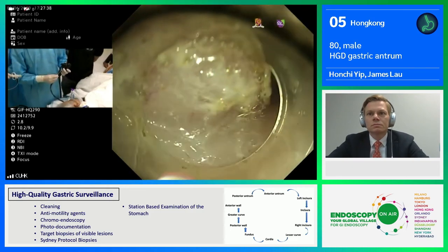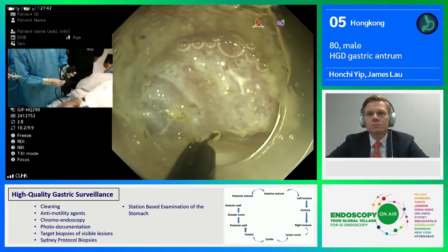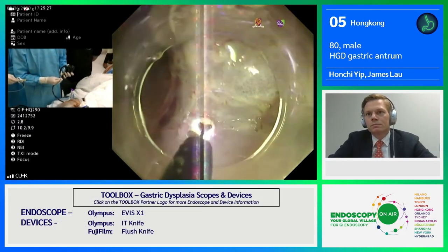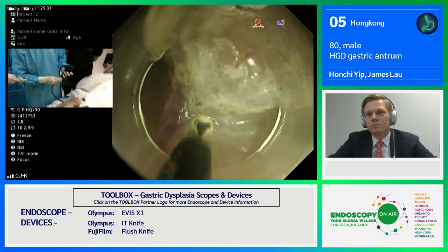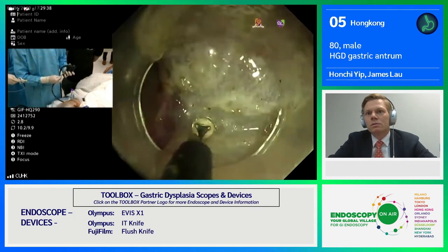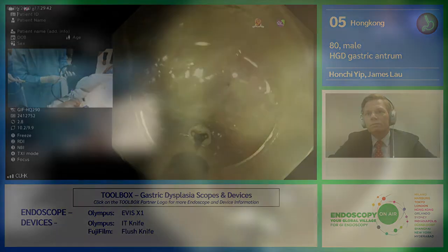For example, if I use the flush knife, I would only use about effect 3 and 45 watts — a different setting. For gastric ESD, it's important that we coagulate all visible vessels to prevent the chance of delayed hemorrhage. I think this vessel is a bit large, so I would use a coag grasper to control it before we cut this vessel.